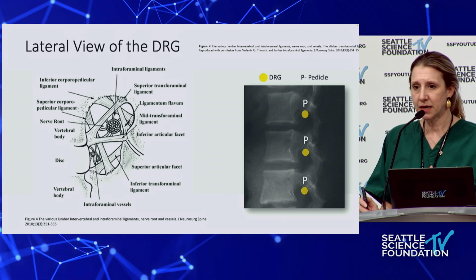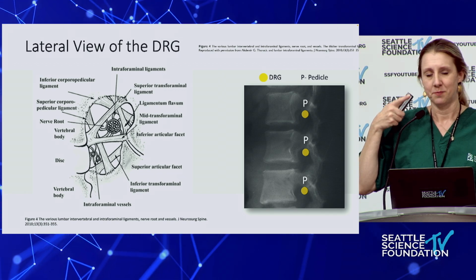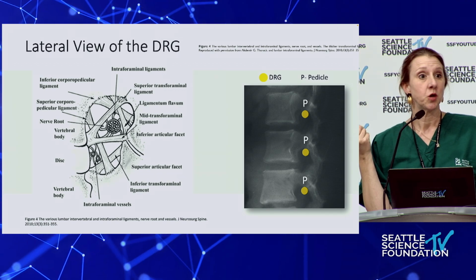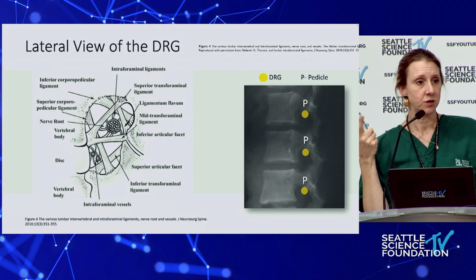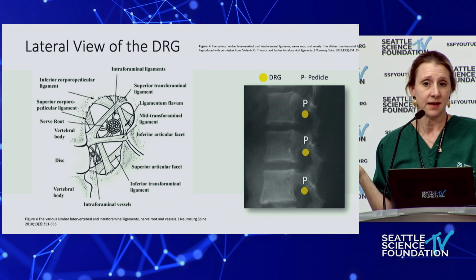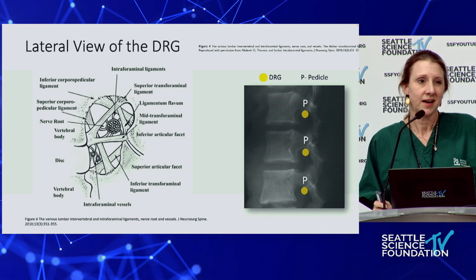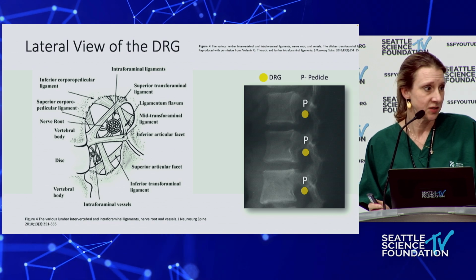So this was, when I was trained for DRG, probably the thing that I took away with the strongest impression. I never understood, never realized how complex the ligamentous structures are within the neural foramen. And I don't think we usually need to know that unless we're doing DRG.